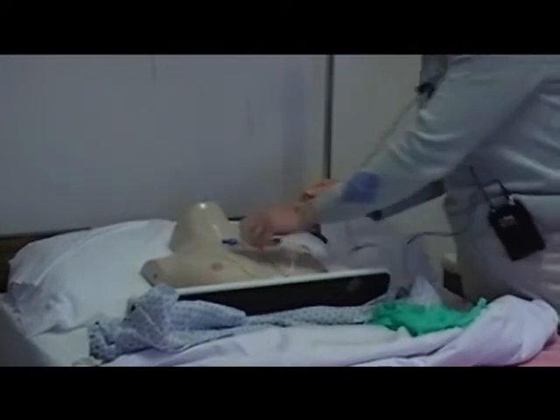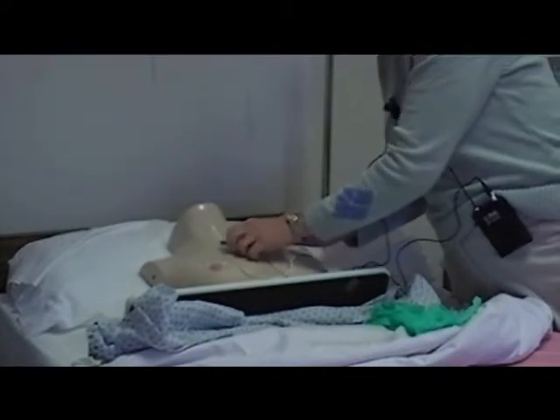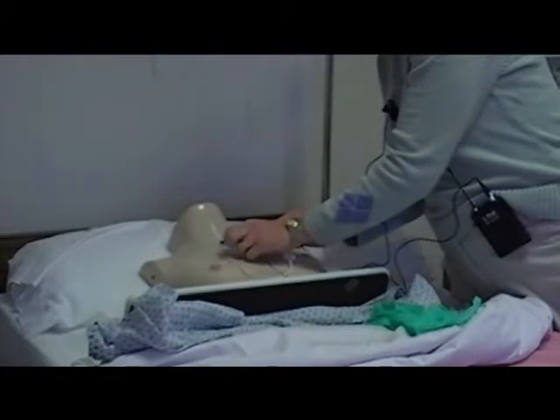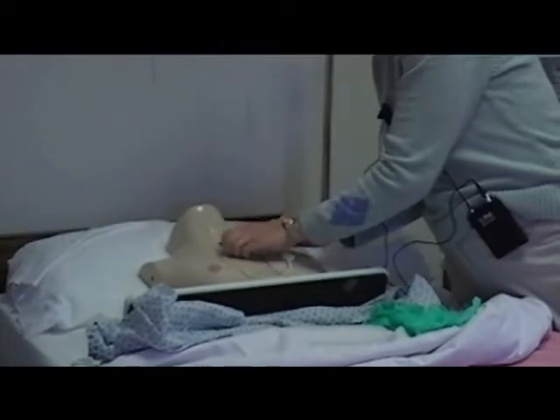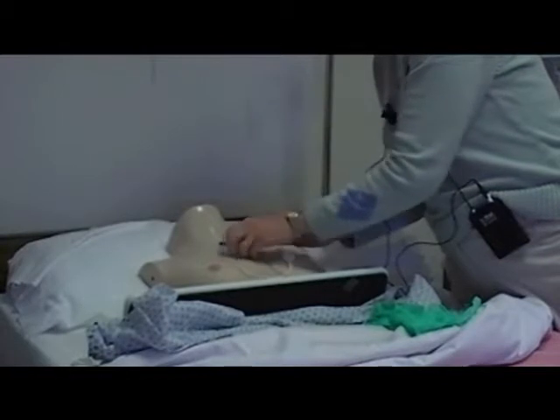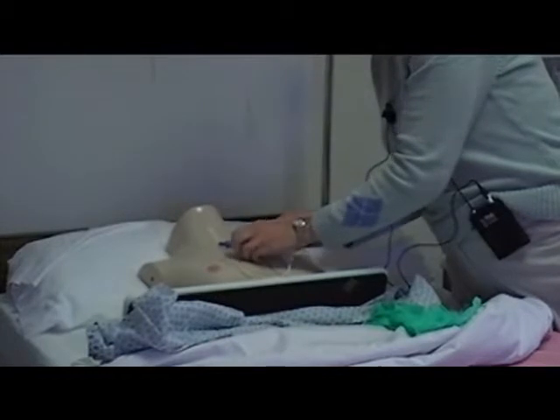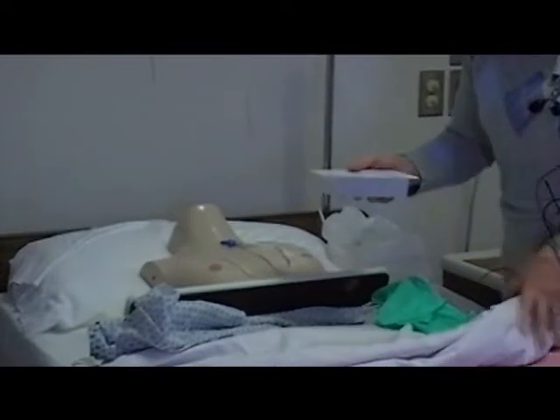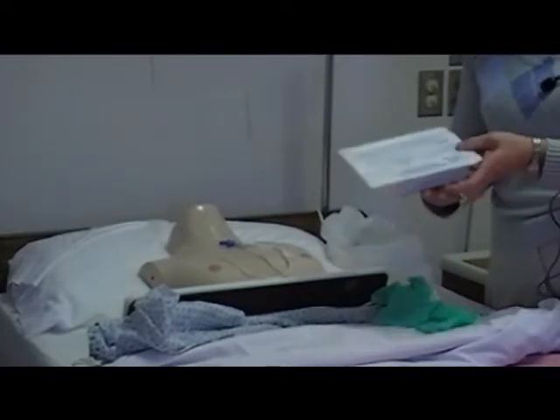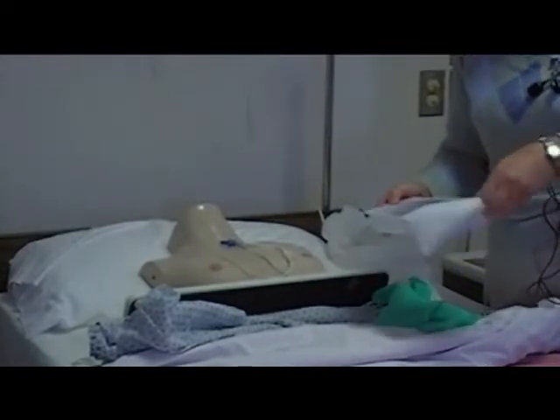Okay, so at this point I'm just going to grab a little corner here of the opposite side so that I'll be able to pull that off easier. Once you get your gloves on, it's going to be hard to get that corner. I've made sure my patient is in a comfortable position. Okay, now I do not want to take the dressing off. I am just loosening a corner. Now at this point I may be needing an assistant to help hand me a few of these things.